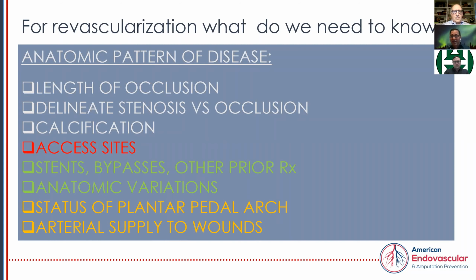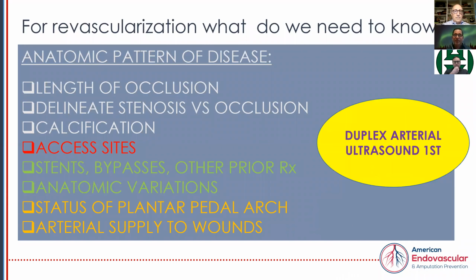And finally, and this is really important as we expand our targets, knowing the status of the plantar pedal arch, and as much as we can, understanding the arterial wound supply is really important, because our goal, as you saw up front, is not just to revascularize a target of opportunity, but to really revascularize the wound artery.